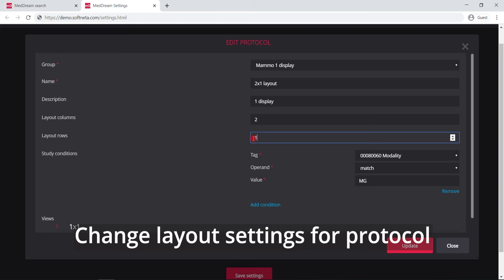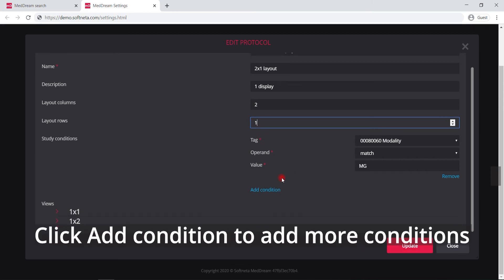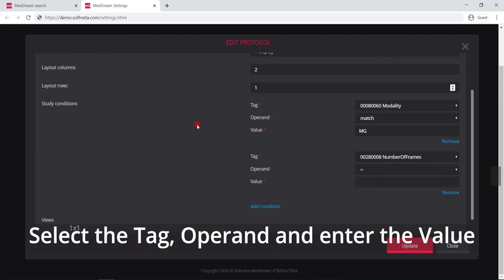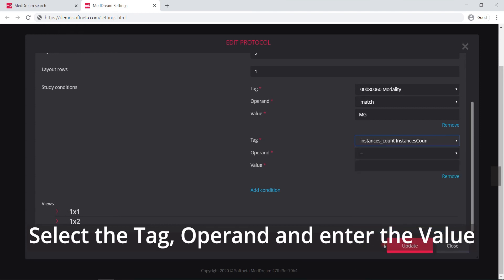Click add condition to add more conditions. Select the tag, operand and enter the value. For example, instances count equals 2.